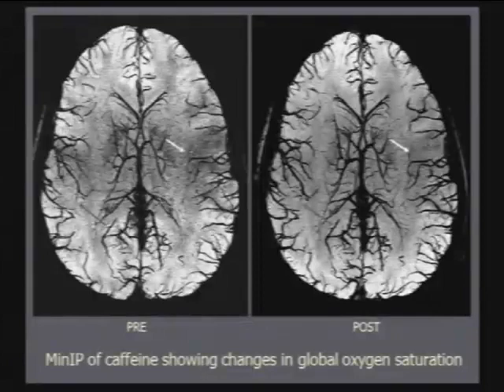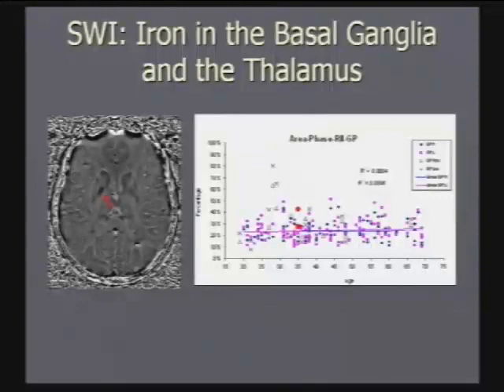And eventually, I can tell you that in some of the lesions, when we do perfusion imaging, we don't see any blood flow there at all on some chronic lesions. That means that tissue is probably ischemic. There's no functioning there at all. If I were to do MR spectroscopy and try to measure NAA, I might not see any present at all. So the longer these lesions are there, probably the worse off the tissue is at that point.